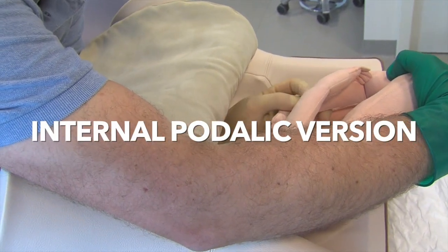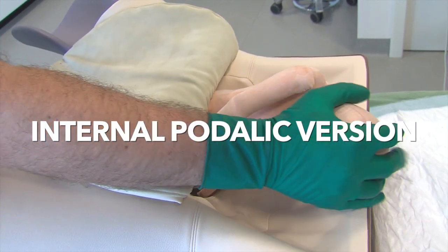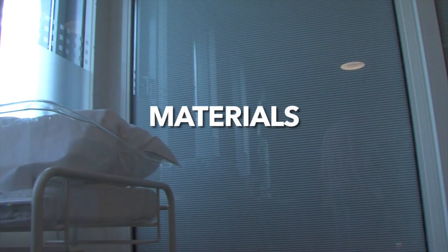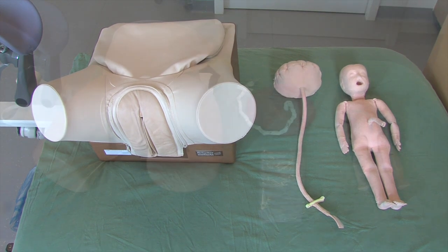In this video, we demonstrate the technique to perform and train internal podalic version of the second twin in cephalic or transverse position. For didactic purposes, a dry pelvic and fetal manikin are used in this video.